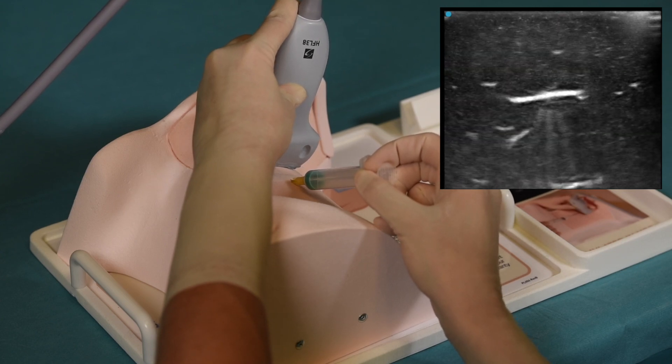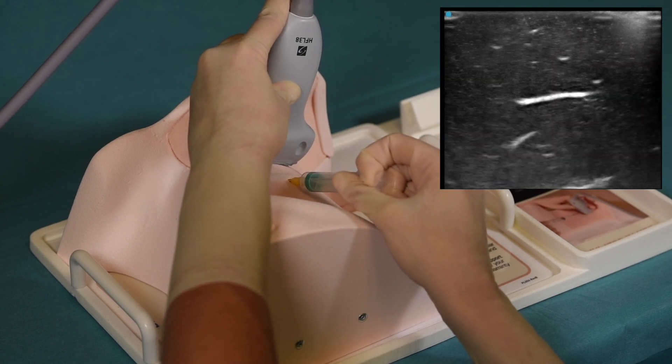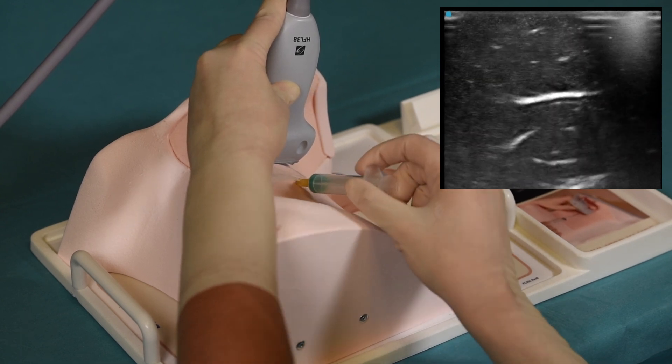The transducer is moved caudally to follow the tip of the needle approaching the internal jugular vein. This represents the practice of vascular access using the internal jugular vein and an out-of-plane approach.